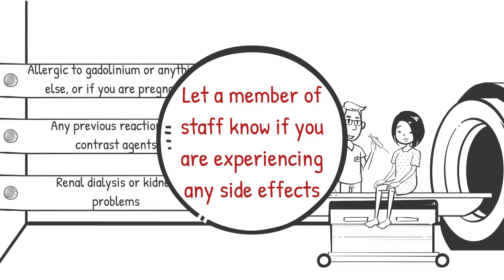Gadolinium contrast agents can have serious side effects, such as nephrogenic systemic fibrosis for anyone with impaired renal function, so it is important to make the radiographer aware if you might have any kidney disease.